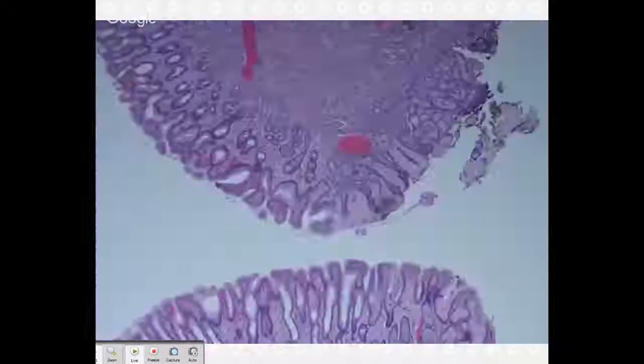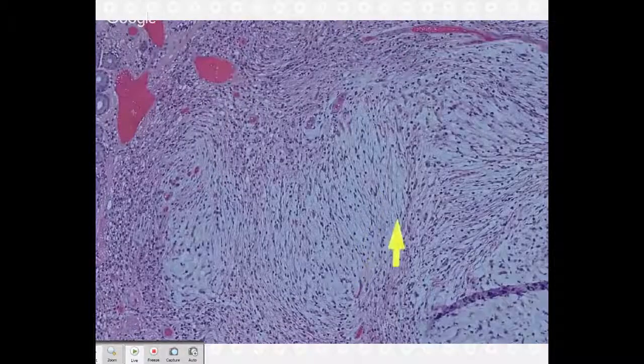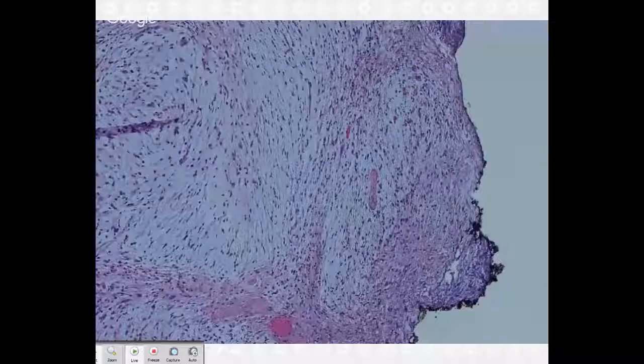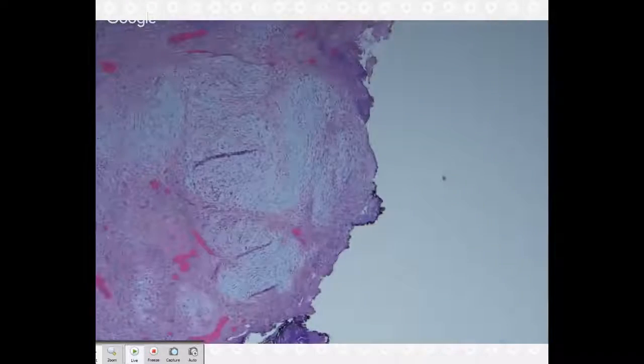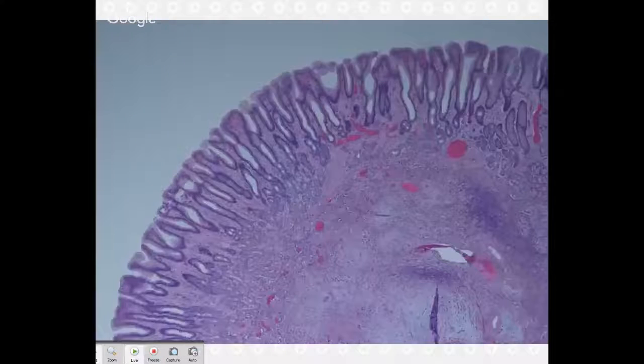So again, we're in the antrum, and they saw this polyp, and then you have this very pale stroma. They didn't get as much of this one because they didn't get as much submucosa, but you have this very, very pale, like you guys said, almost bluish myxoid-looking, edematous stroma. You get closer to it, you have very monotonous, even spindlier, more spindled cells, lots of eosinophils. In this one we don't really have much of the lesion, but you can tell there would have been prominent vasculature if we had gotten more of it. But again, submucosal base.